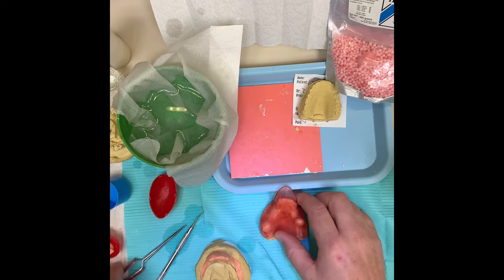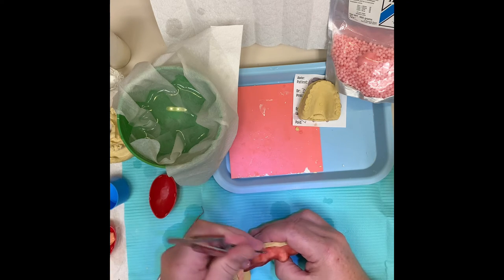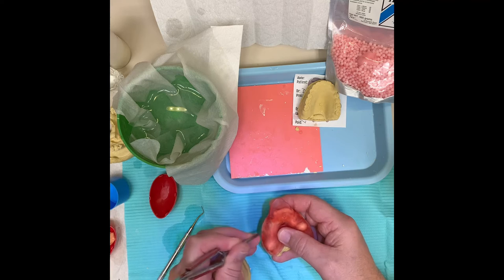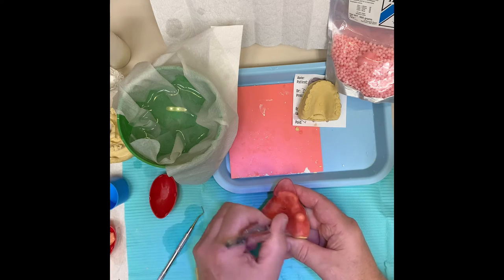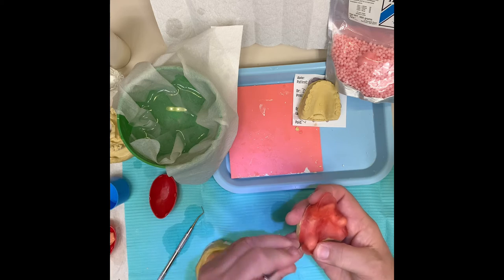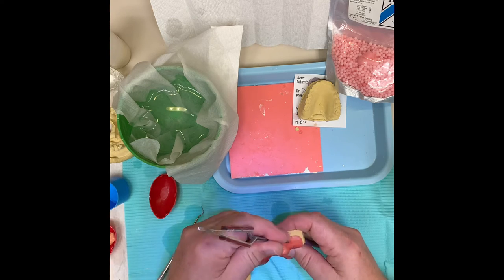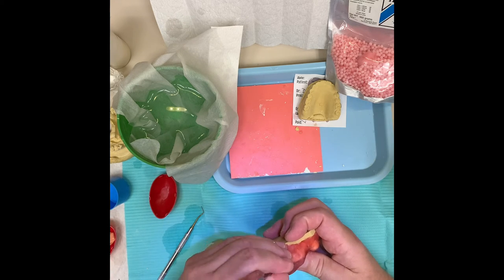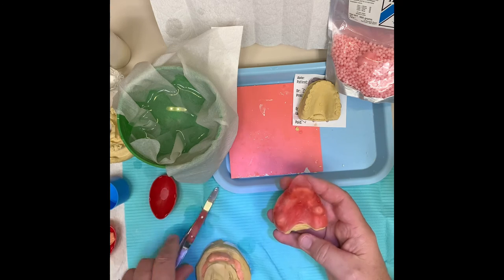If you want to make a perforated tray, just take a blunt instrument and kind of score the model. You can do this after as well. I like to do it now and then go through with a low-speed round burr on a lab drill and drill through the tray, but it's good to have these preliminary holes while it's soft so you don't have to do as much drilling. You can use the same holes and just open them up a little bit after the material has hardened.